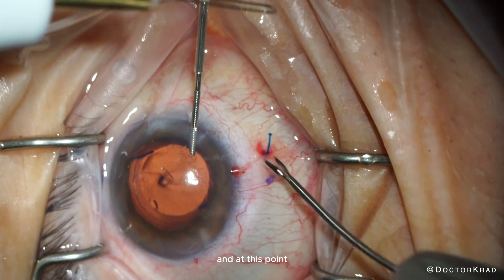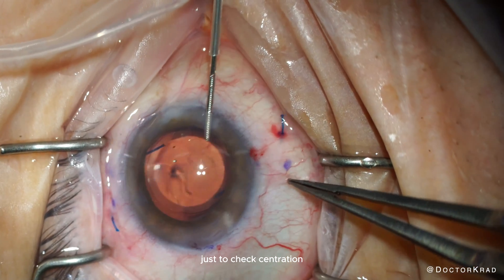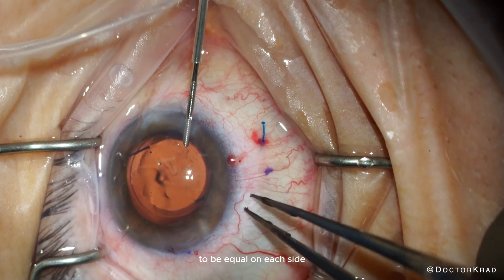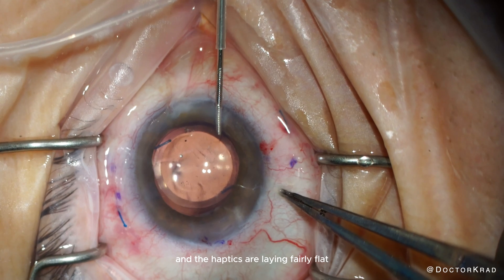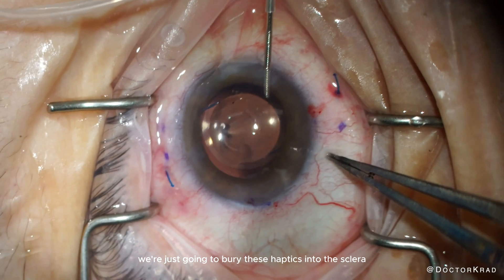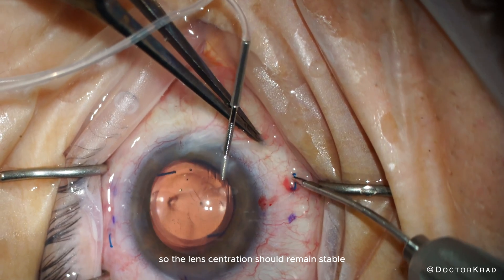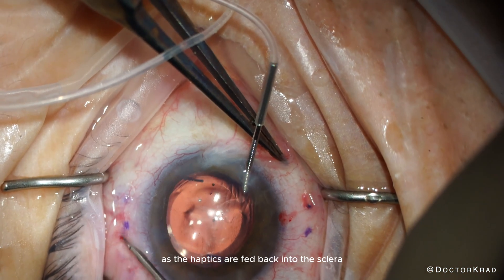At this point, the lens is secure. I bring the eye to primary position to check centration. If the IOL is well centered, you expect the length of exposed haptic to be equal on each side — which it is. The haptics are laying fairly flat, which means you have a decent tunnel. The exposed haptic lengths are symmetrical on both sides, so lens centration should remain stable as the haptics are fed back into the sclera.